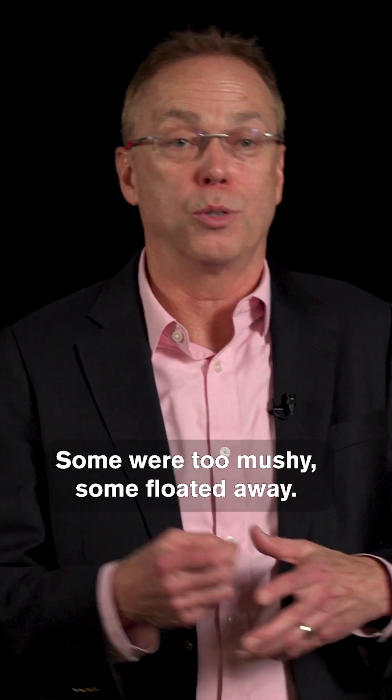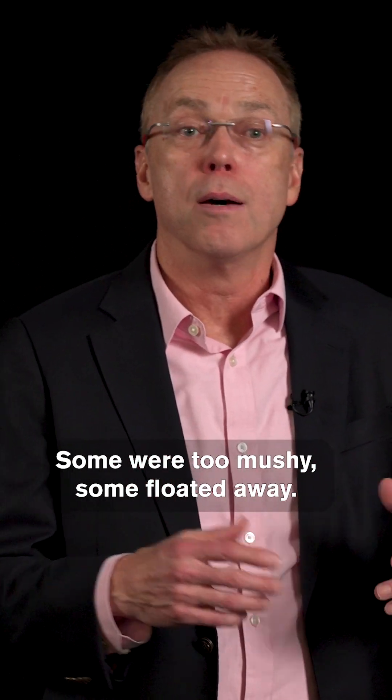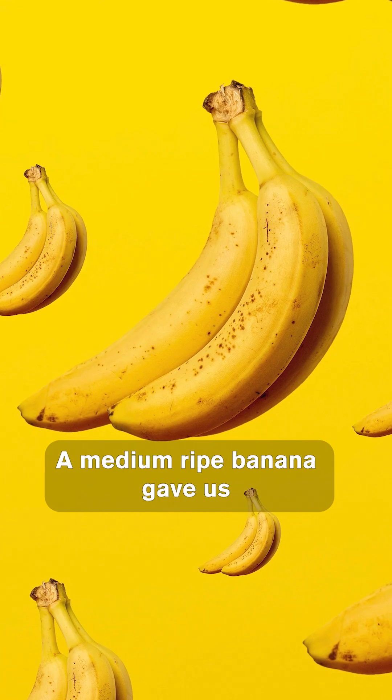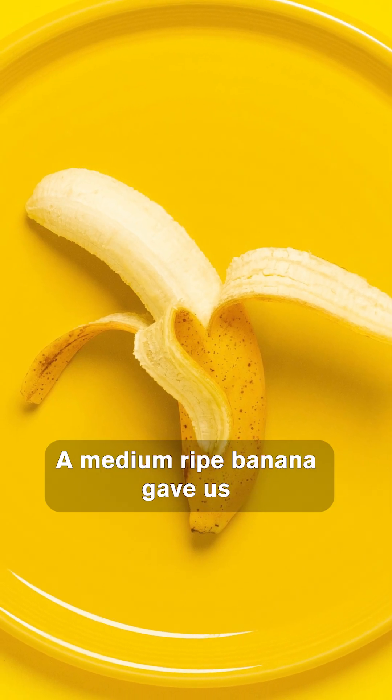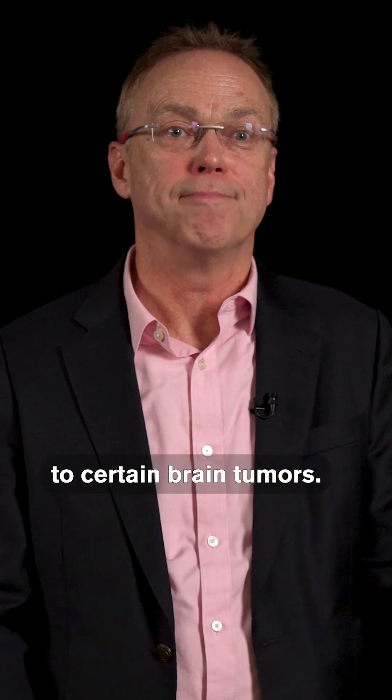And some were too mushy, some floated away. But then the banana — it was perfect. A medium-ripe banana gave us the consistency we wanted and allowed us to suck out the tumor in a very similar way to certain brain tumors.